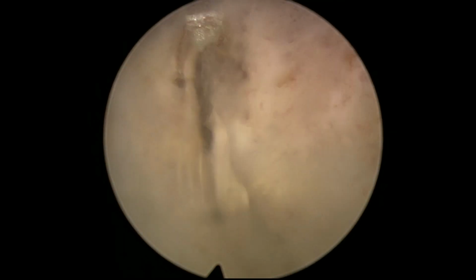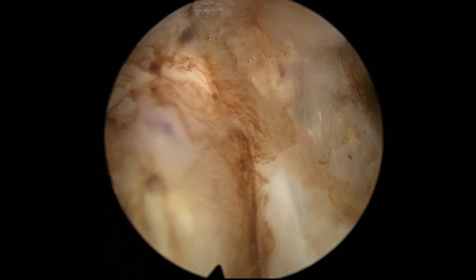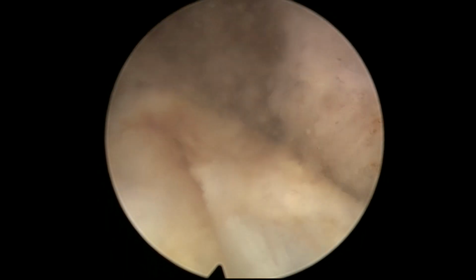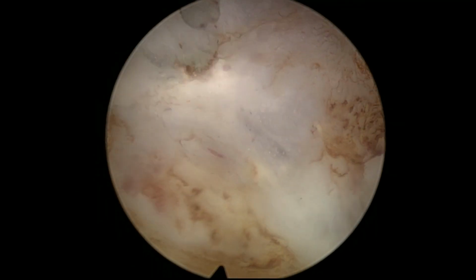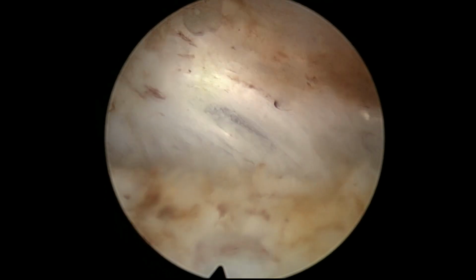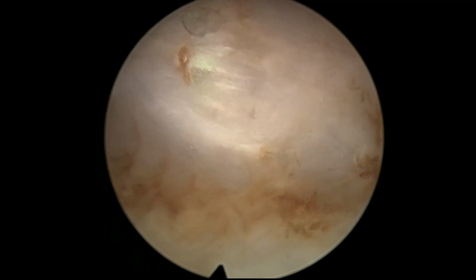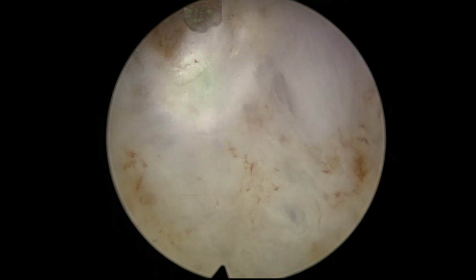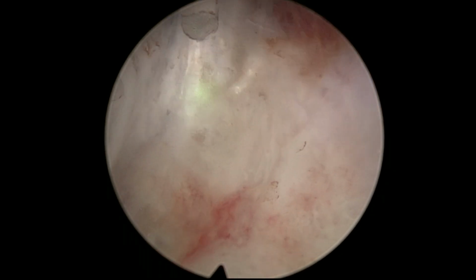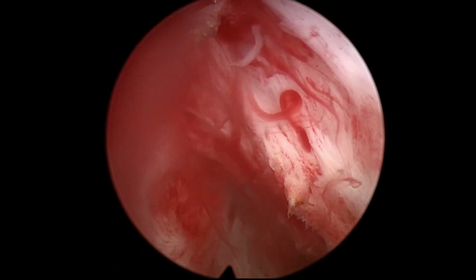What I really believe is that with the new generation lasers, so this means this laser as opposed to the classic thulium, and the pulse modulation holmium lasers as opposed to the classic holmium lasers, and also the inclusion of these thulium fiber lasers, which have a different mechanism of laser production. So I think with these newer lasers, the new generation of these existing lasers and the new thulium fiber laser, probably we have tools that are better than the previous ones. But we still have to learn what is, let's say, hype, what is company-driven concepts and evaluation, and what is the truth, or what is the clinical experience that we can get in our hands.